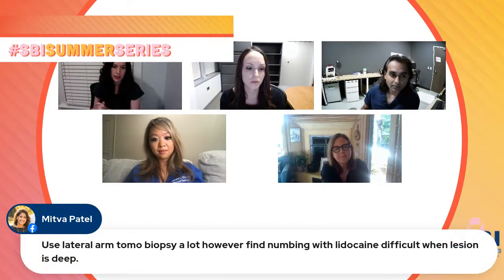And then I just got very accustomed to doing the seed, and I found that it was very accurate when you deployed it right where you would expect it to be. With the Savvy Scout, you have to be a little anterior to the lesion as you uncover it, I think 6 millimeters from what I remember. So I just felt a little more facile and quicker with the RadioSeed, because I'm always trying to do the procedures as quickly and accurately as possible for the patient's comfort.